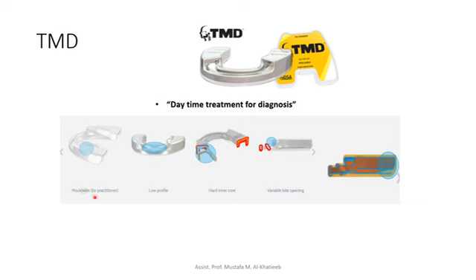It has moldable by the practitioner with anterior orifice or space. It has low profile, hard inner core, and also variable bite opening. So there is an anterior opening inside it.